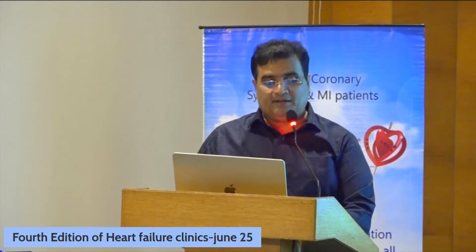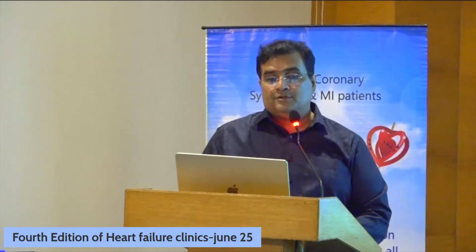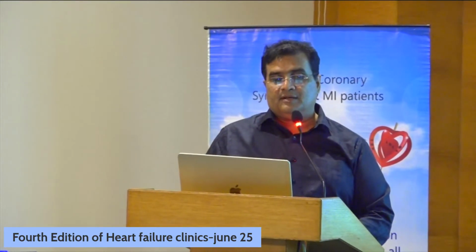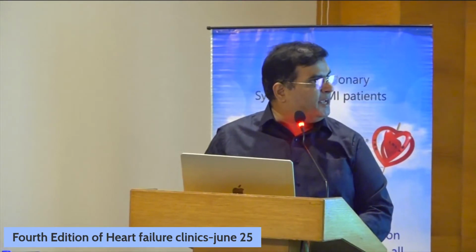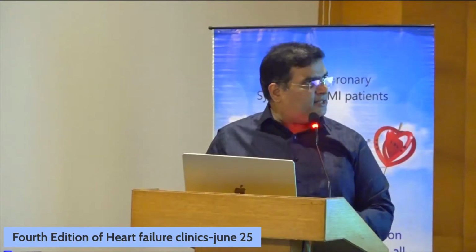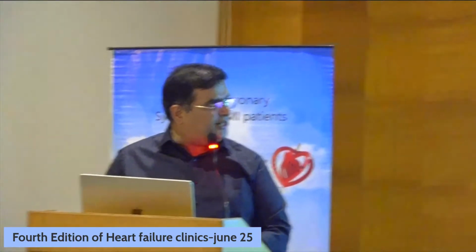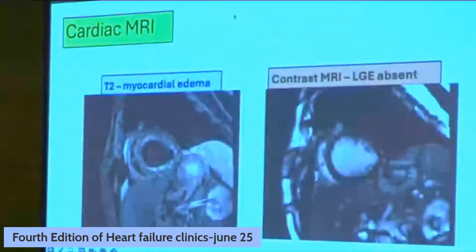So if you can see here, there is significant disease in the left main and significant disease in the LAD, and the ventricle is hardly contracting. I thought that this patient has significant ventricular dysfunction and we need to treat him.